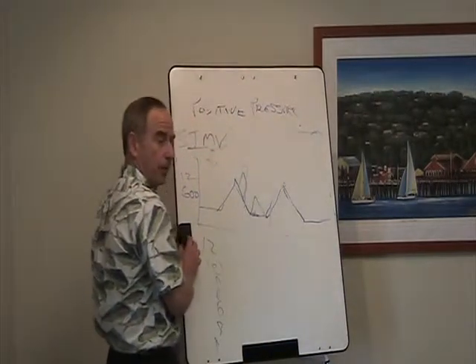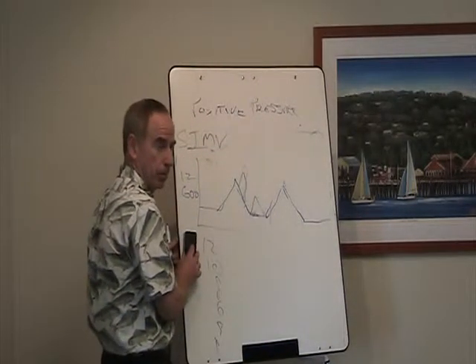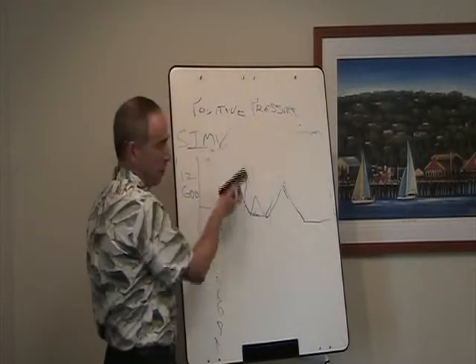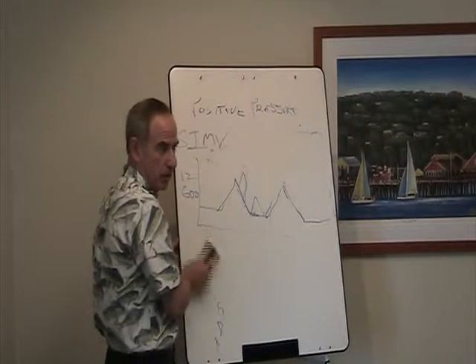Questions about IMV or SIMV? Is IMV used? It's always SIMV now. All ventilators have SIMV. There's no such thing as just IMV.